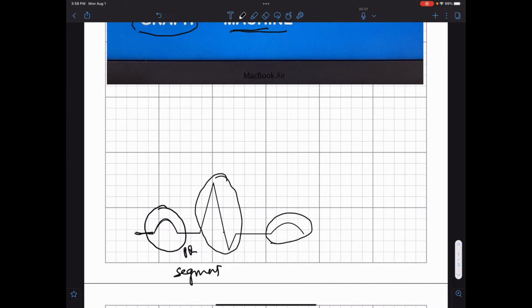Now, the P wave is usually 2.5 millimeter tall, that is from this place to this place, and 2.5 millimeter broad. So the 2.5 figure is important in the P wave. If anything is more than that, that makes the P wave abnormal, which we will be discussing subsequently. Now this is followed by the PR segment, which is followed by a wave complex known as the QRS complex.